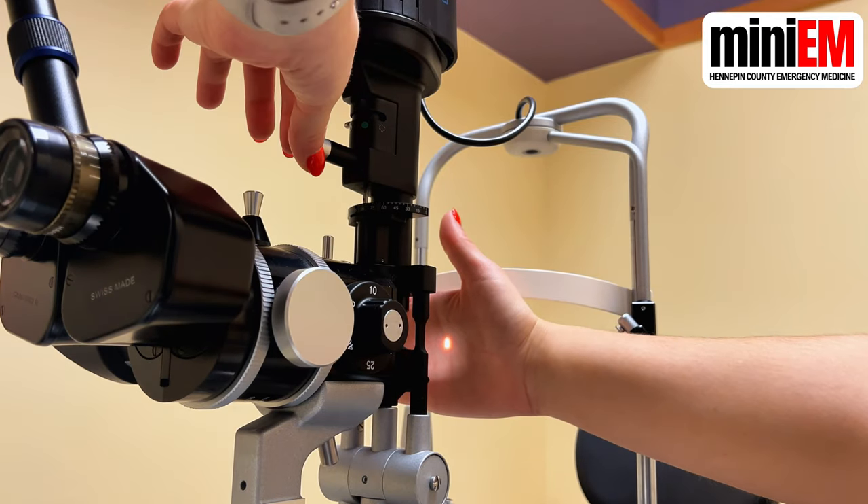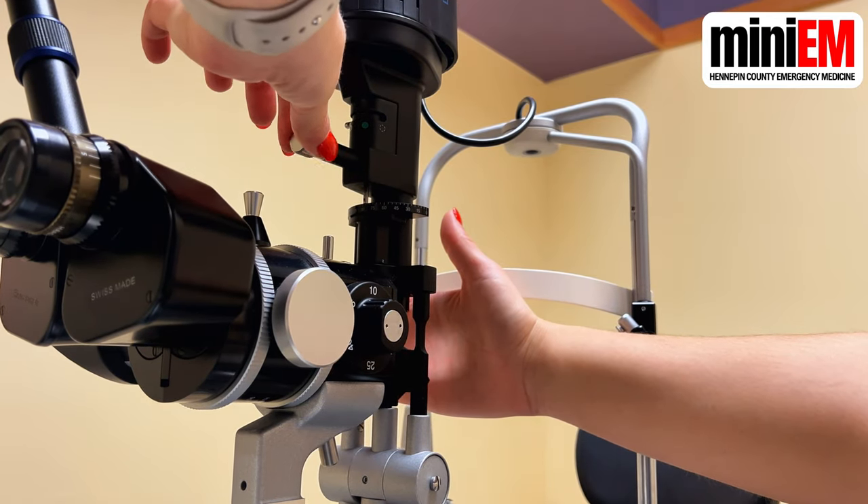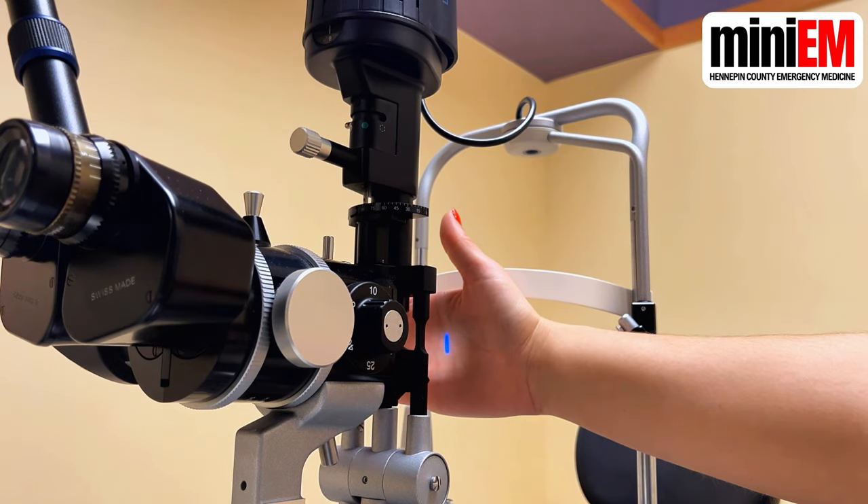Use this vertical knob to make your light beam taller. If you turn it all the way, it's going to turn blue, and this is the blue light that you'll use for fluorescein exams.